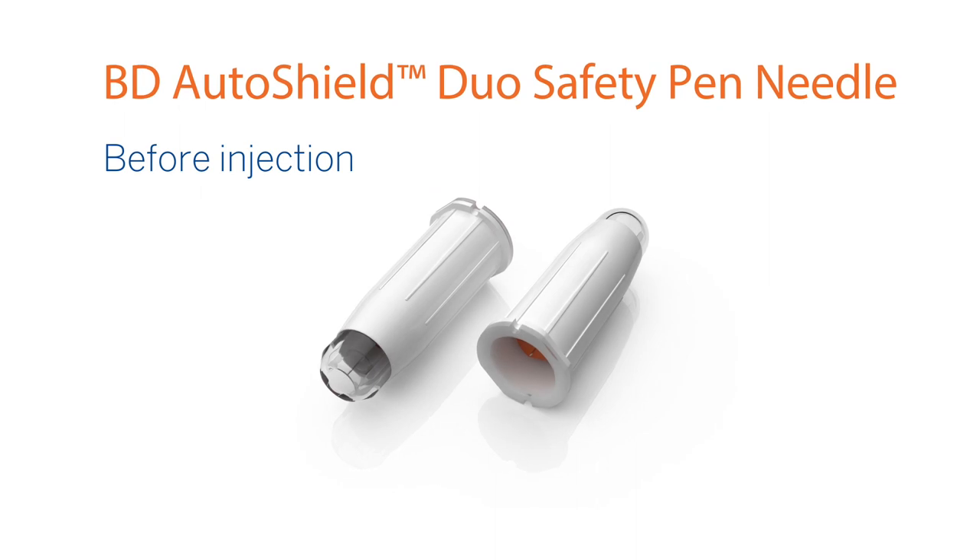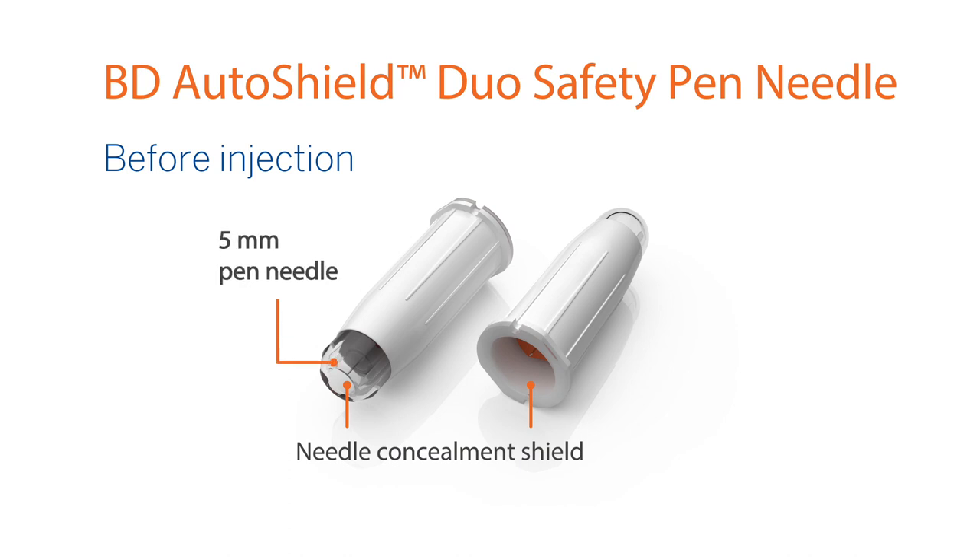BD AutoShield Duo Safety Pen Needle offers a high level of protection for healthcare workers and patients with a needle concealment shield so that patients don't have to see or be intimidated by the needle, and a 5 mm pen needle for a one-handed, no-pinch-up injection providing lower risk of needle stick injuries for healthcare workers.